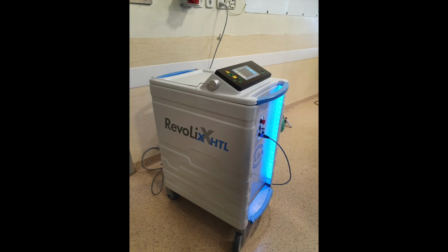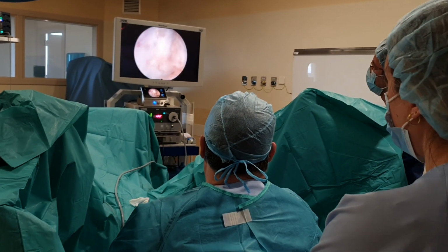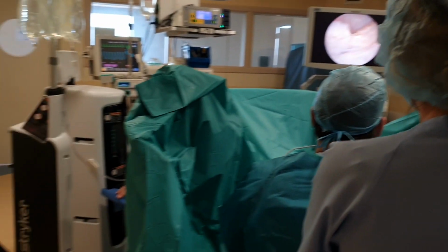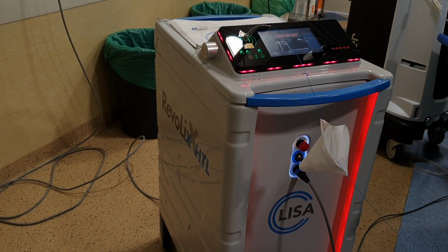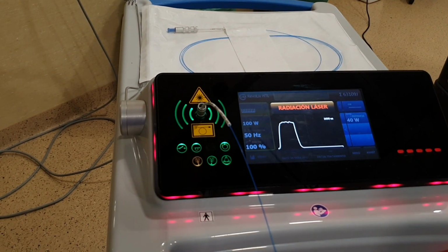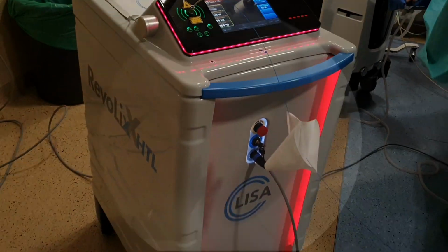Hello, this is Fernando Gómez Sancha, and this is the first video in this channel that will showcase cases of an atomic enucleation performed with the solid-state thulium YAG pulsed laser from LISA Laser. They have lent us the laser so we can produce this channel.